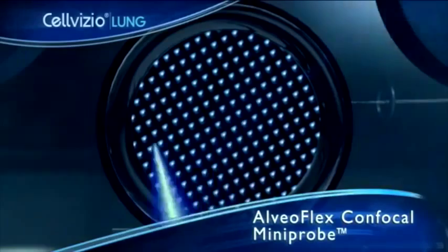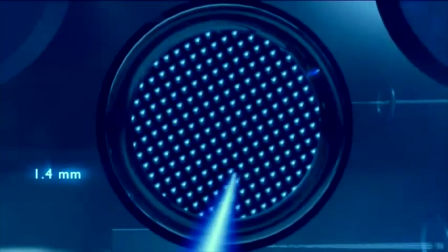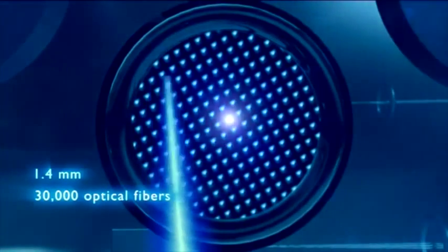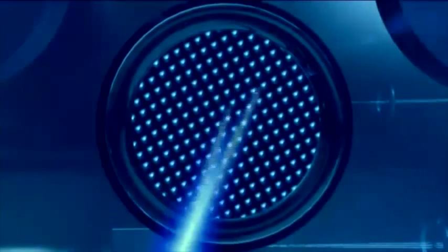The AlveoFlex confocal mini probe is 1.4 millimeters in diameter and is comprised of 30,000 optical fibers. The core of each fiber is 1.9 micron. Each fiber is injected 12 times per second in a rapid sequence, one after the other.